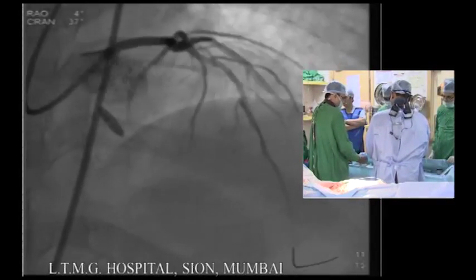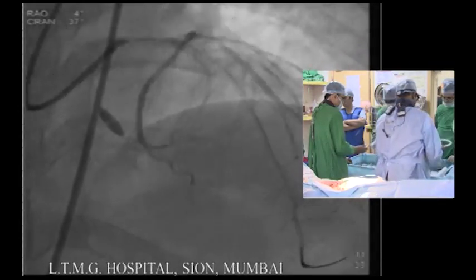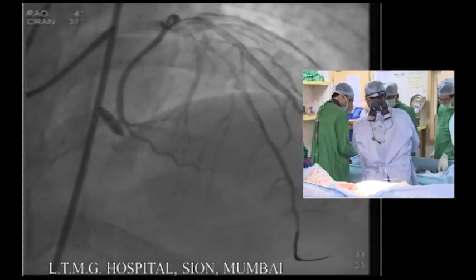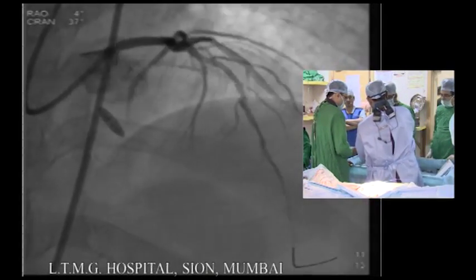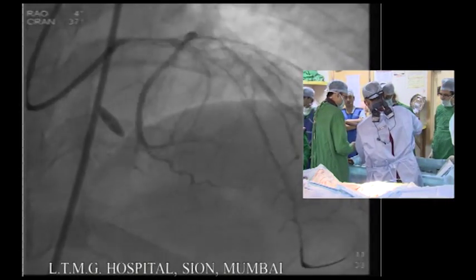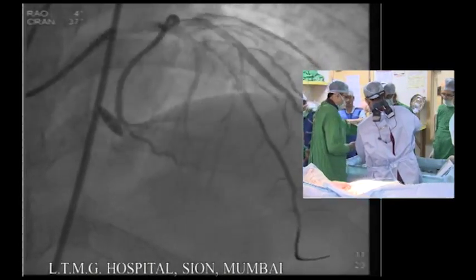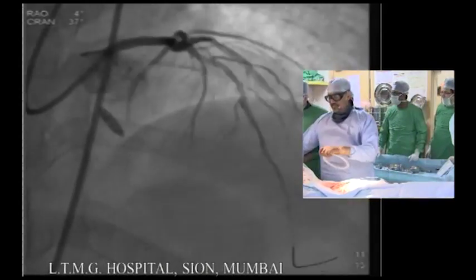So while we're waiting, sir, just as a panel, from where distally would you start your stent? Could you put the light a little bit up? Lights up. So let me ask the audience, if anybody wants to come and furnish their opinion, how will they do this case?